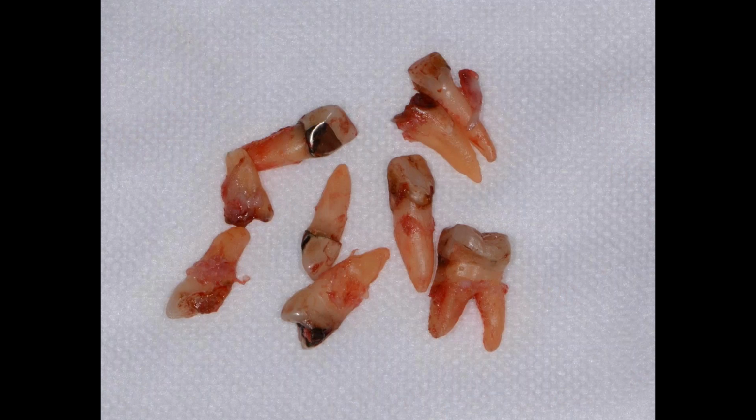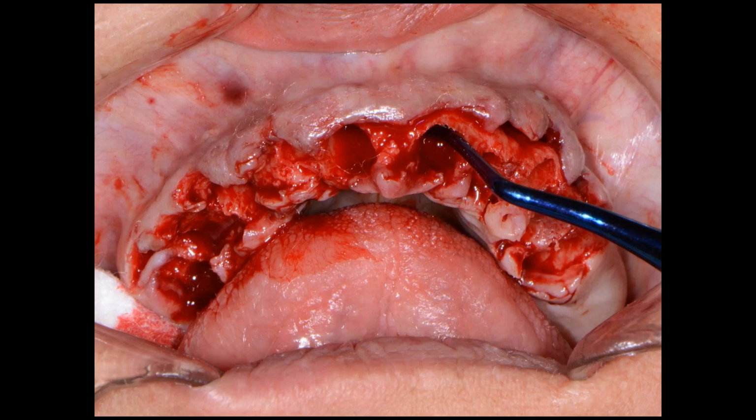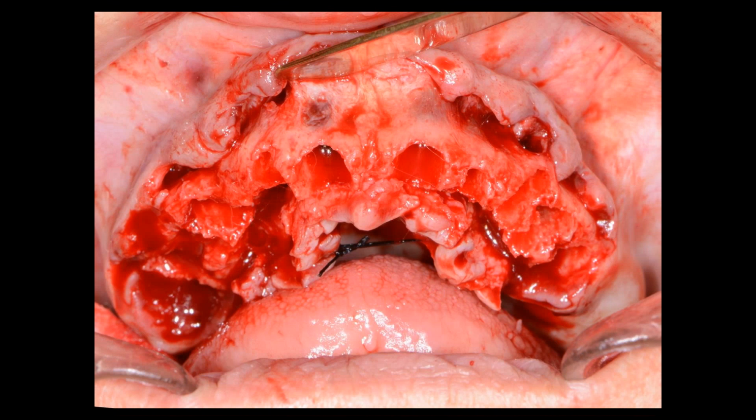And then the teeth that have no restorations, or even the ones that do have restorations, if there's a crown on it without a root canal, we can section that crown off or just section the tooth and maintain the root structure for the Dentin Grinder. Here we see illustrated how I'm curetting the area out. We want to initiate bleeding, but most importantly, remove any type of infection or granulation tissue from the area.